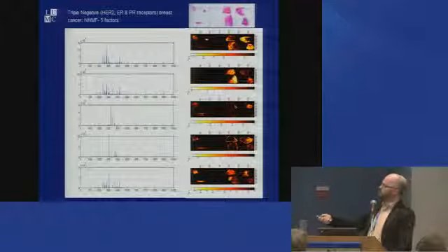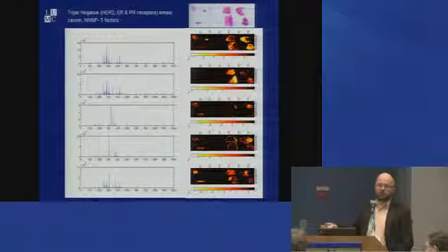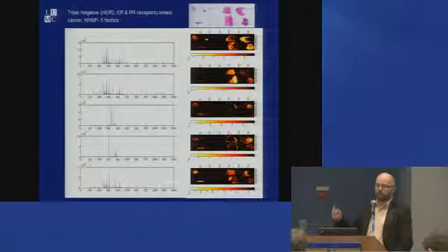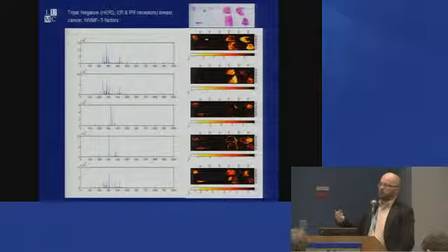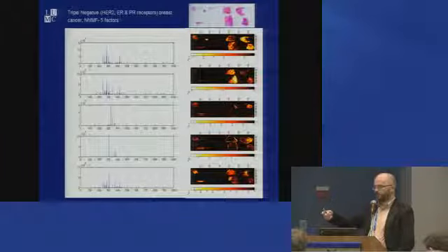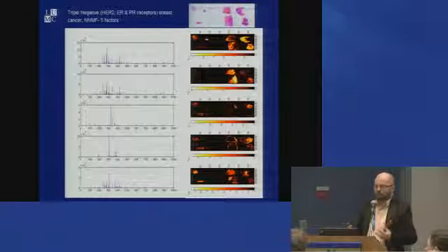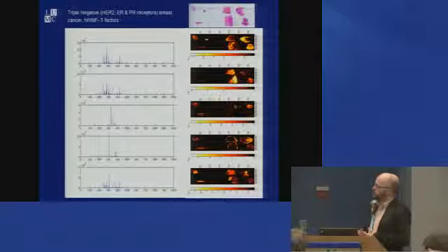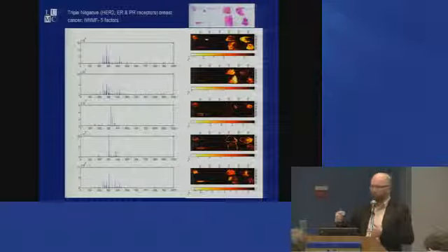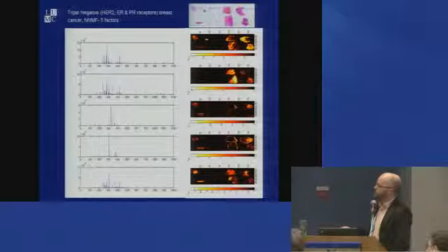I shall not. And what we see is basically, in this case, we chose 5 factors. Why did we choose 5 factors? We used a corrected Akaike information criterion, which gives you an estimate of the best number of factors for your data. As you increase the number of factors, you could match your original data better, but well, that's always going to be the case, of course. If you want to reduce it to a number of real factors, there's actually a penalty for increasing the number of factors. So this is a common method by which you can try to estimate the number of factors.